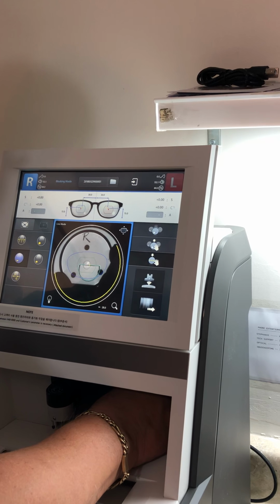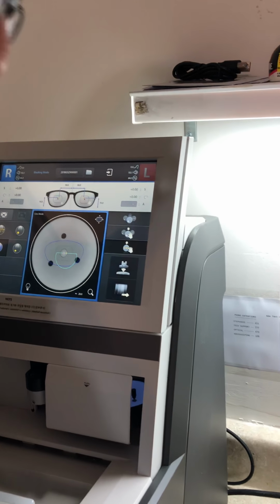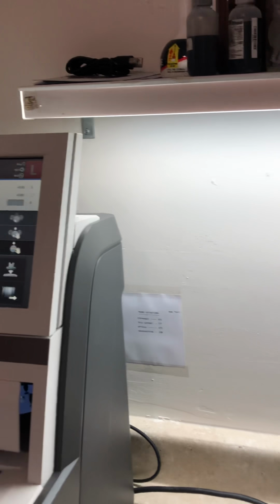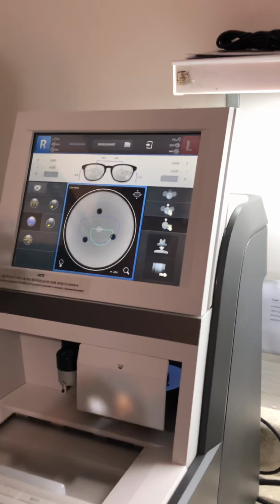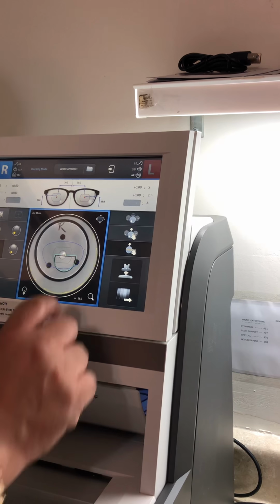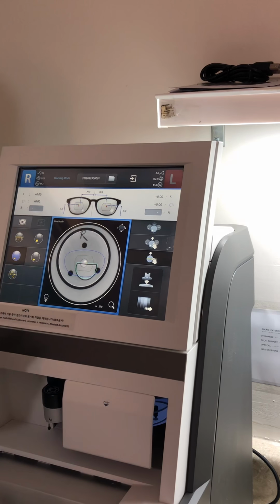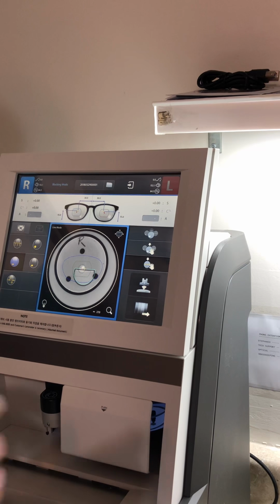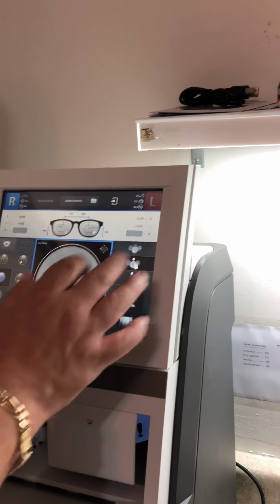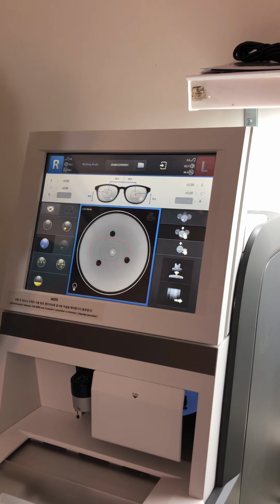See, even right here, this is a 28, and this is a flat top 28. But with the add power that this has, which is a 250 add, but it's a high plus, it makes everything smaller. So if I needed to do this, then I would be able to bring him down here to get it to identify. I could move him around till I get it there. Or what I could do, and what I always do, I like to let the camera pick up the flat top 28s.